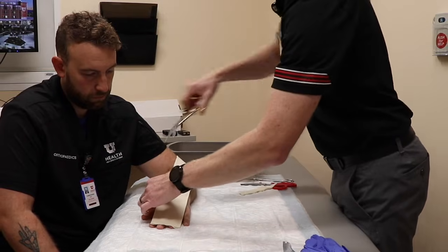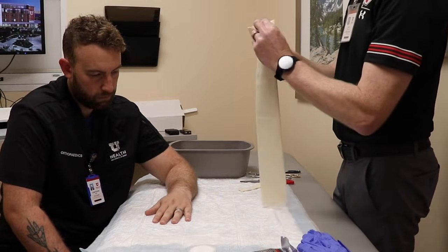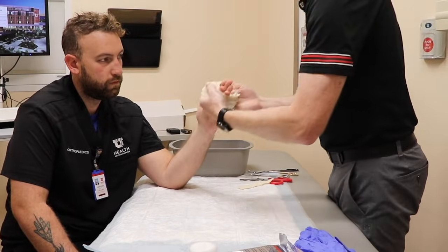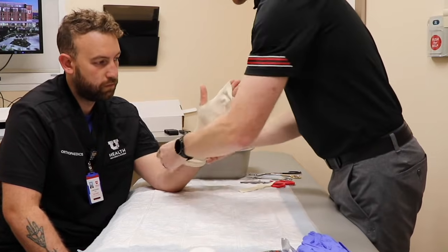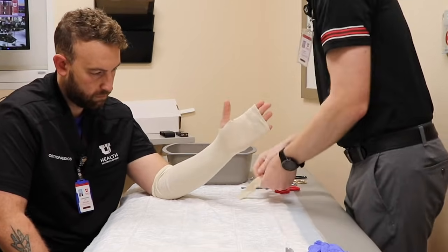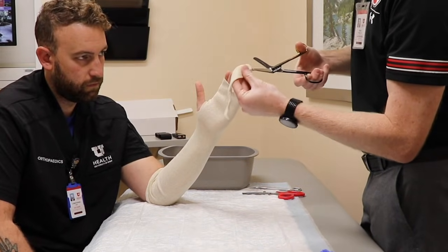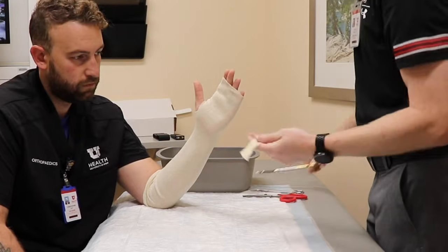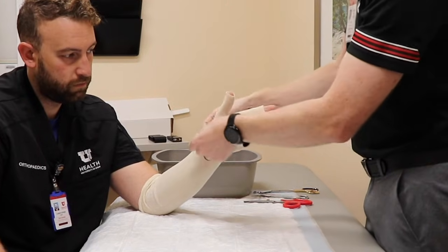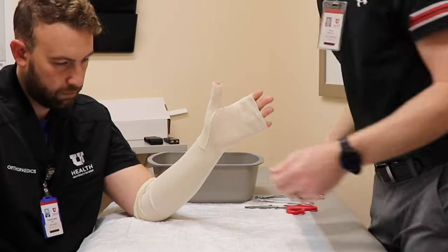The first thing I'm going to do is make a little slit right where the thumb is going to go. You can put your arm up like you are going to arm wrestle me. Just making sure that the stockinette is nice and smooth, no wrinkles. With the thumb piece I'm going to make a slit about halfway up along the edge, and I'm going to cape it right over the thumb and down the wrist. That cape is going to actually help hold it in place once I cast the arm.